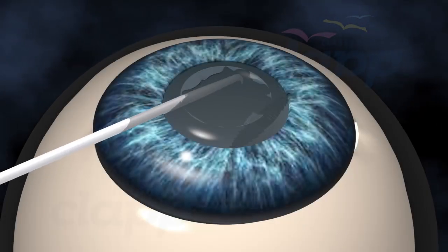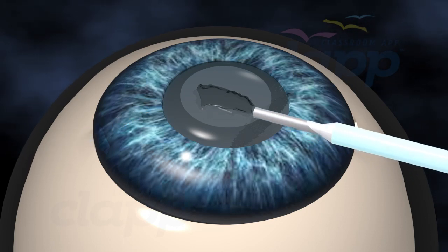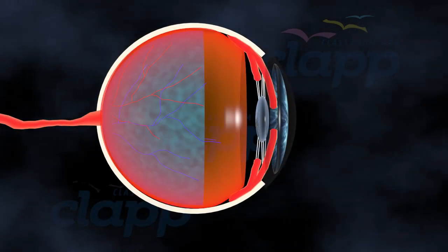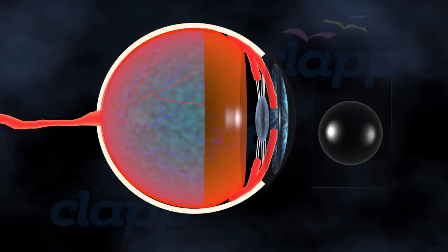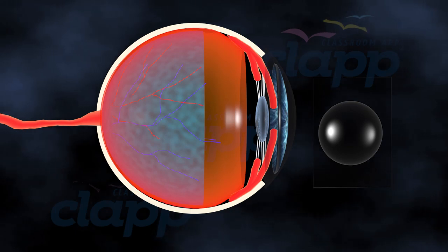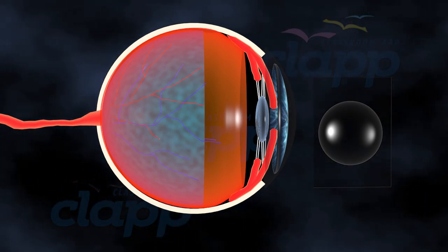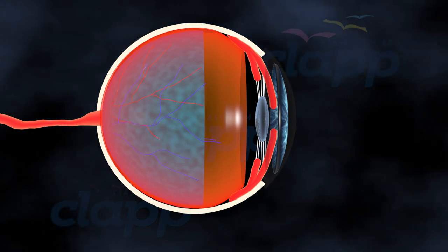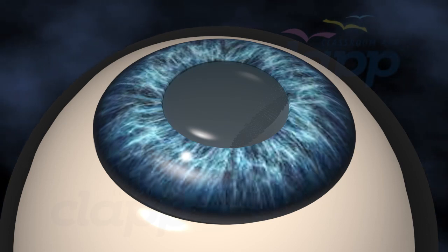When cataracts significantly impair your vision and impact daily activities, cataract surgery becomes an option. During the surgery, the cloudy lens is removed and replaced with an artificial lens called an intraocular lens, restoring clear vision. It's one of the most common and successful surgeries performed worldwide. It's a relatively quick and painless procedure that usually takes less than 30 minutes.